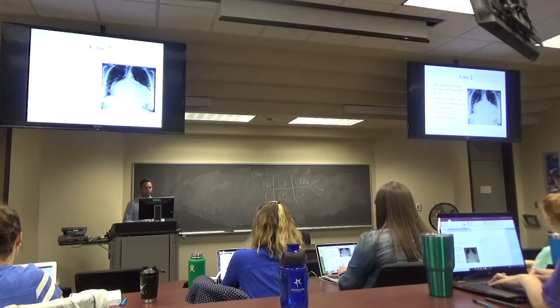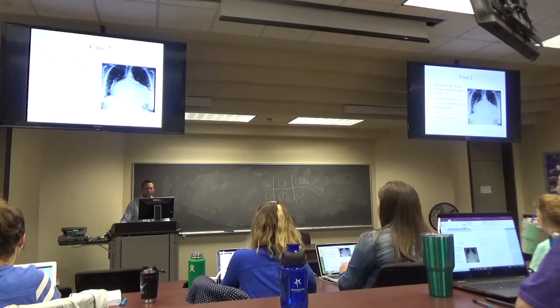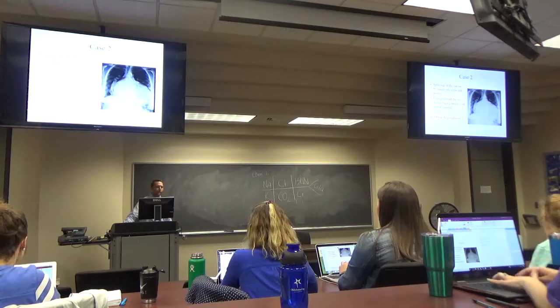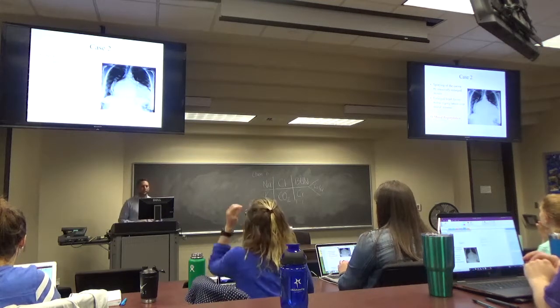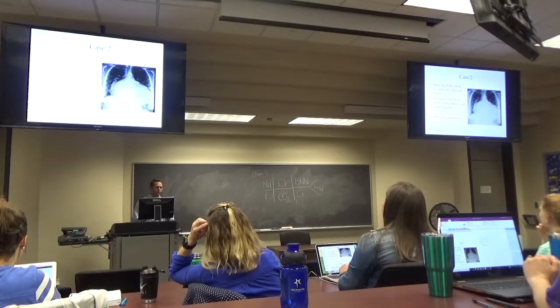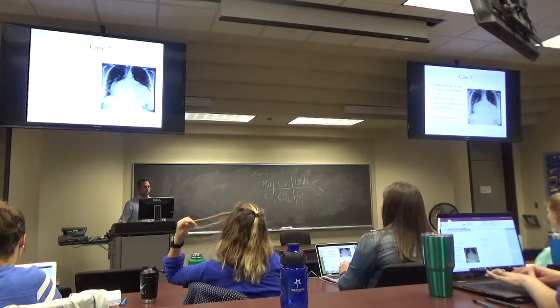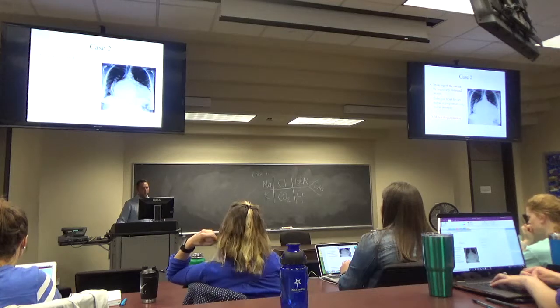What's the ringy thing? Which one? Down the middle, there's those. Oh, these? Yeah. Oh, okay, so this is a change of median sternotomy wires. When someone has coronary artery bypass grafting, if you've ever seen any type of cardiac surgery, they basically have to pry open your chest and then close everything with sternotomy wires. So that's typical for a patient that's gone through a CABG procedure or had their heart opened up for any reason.